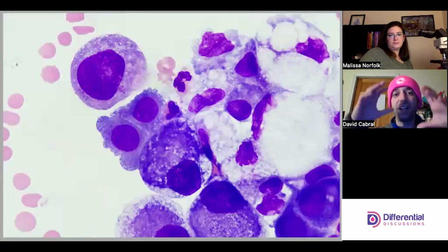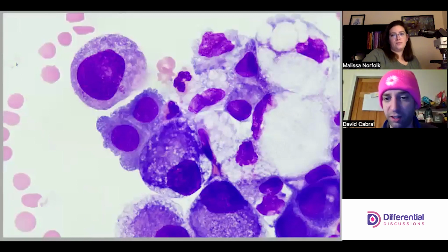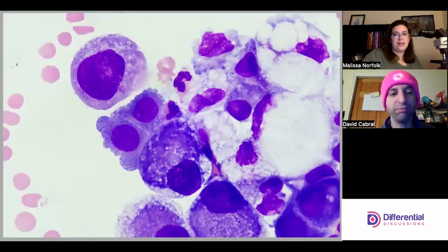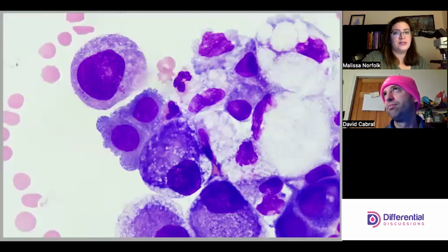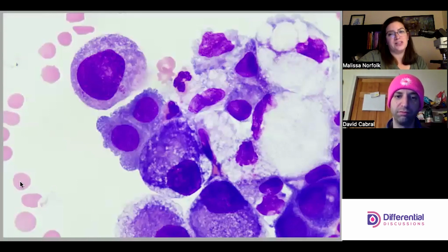And again, look at that nuclear membrane, much smoother, and consistency in the general size and volume of the cell. And the blebs are normal for them. They should be blebby like that. So it's not just the malignant cells that are blebby. That's why mesos are so challenging, because they can look ugly. But these are just normal blebs, and you can see where the nucleus ends and the cytoplasm begins. You can see the separation between the cells, so it's a little bit more clear as compared to looking at some of these more malignant cells.